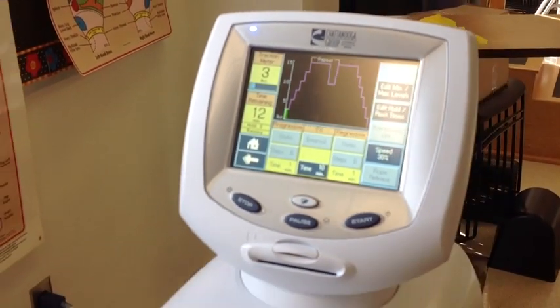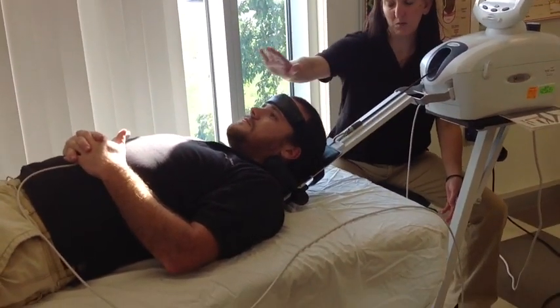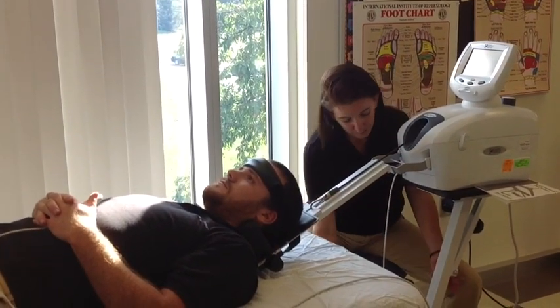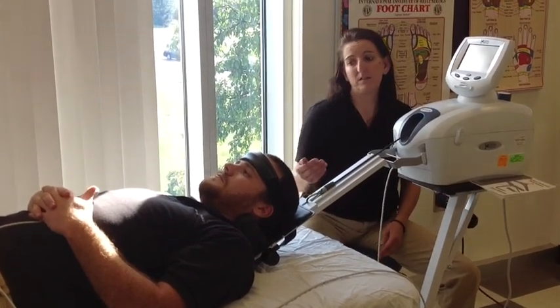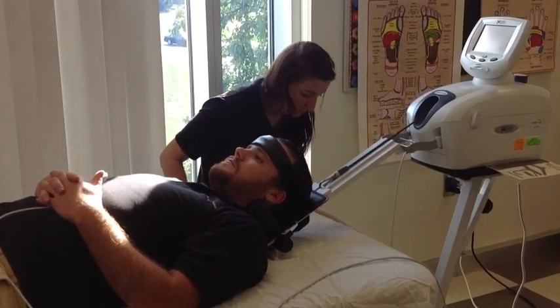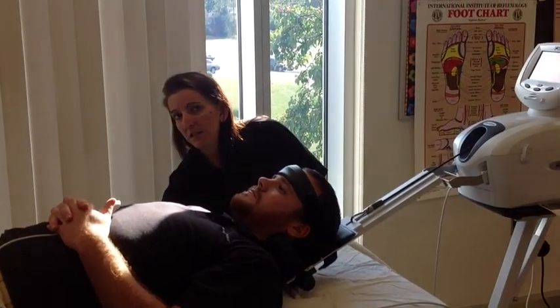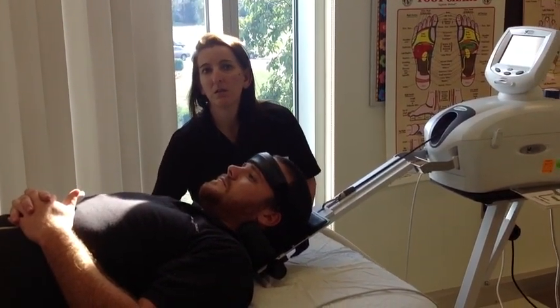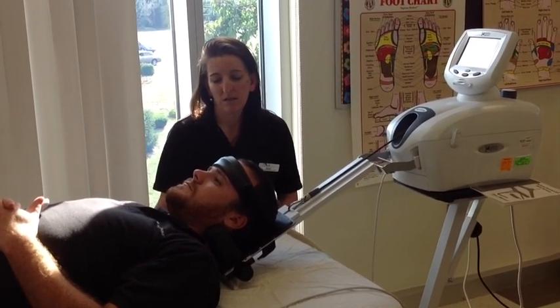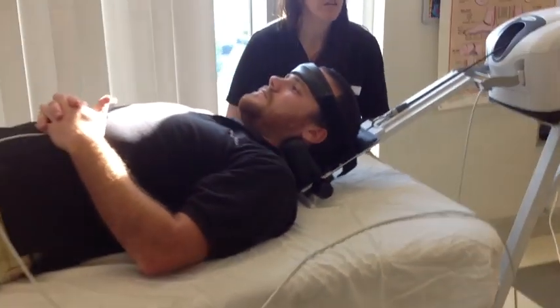On cervical traction, you're normally going to pull the head straight back toward you, so the unit is always directly behind the patient. If you're doing something more directed to the right side, you can rotate the unit so it pulls more on that side. Also, for full spinal traction using the cervical traction part, the table would be level instead of at that incline, and the traction unit would be more level with the table, pulling further down the spine rather than just the cervical part.